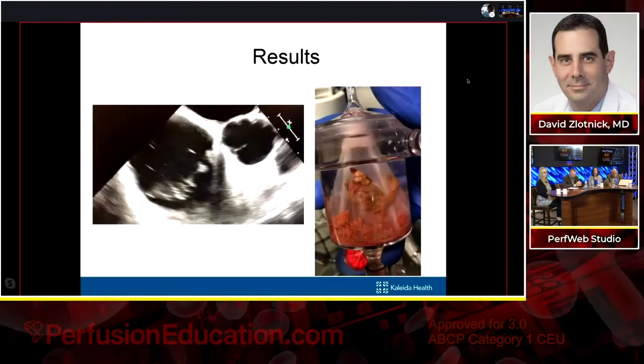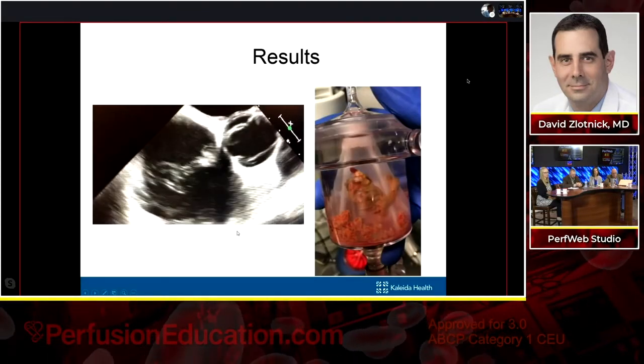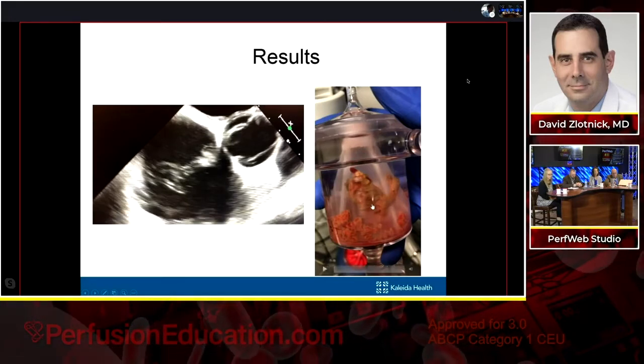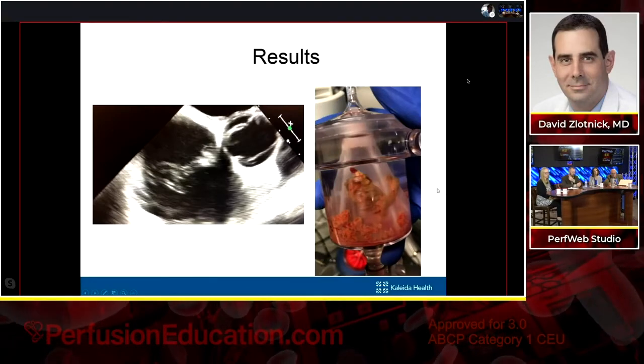I'll just pause that video, but we had a rapid debulking, and you can see that we had a lot of the material in the filter afterwards.